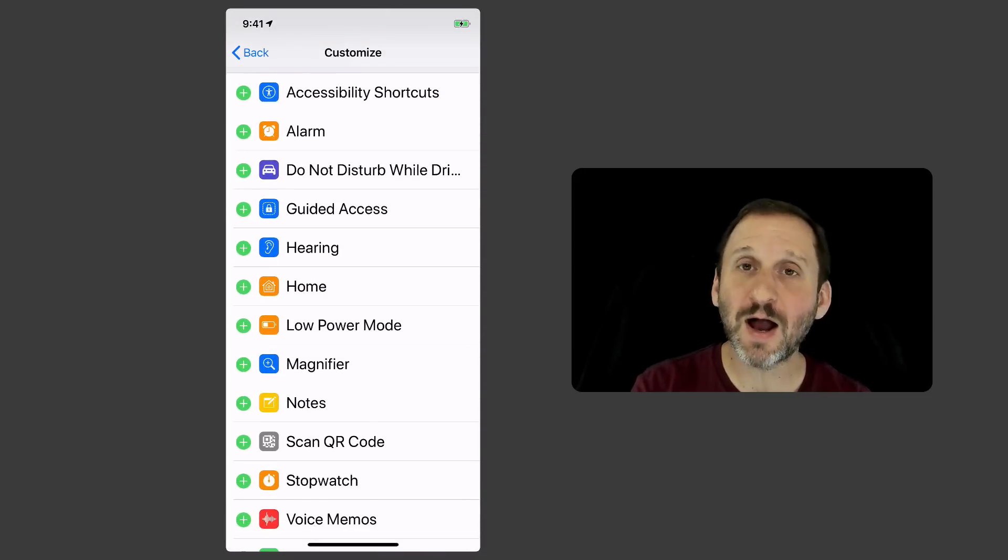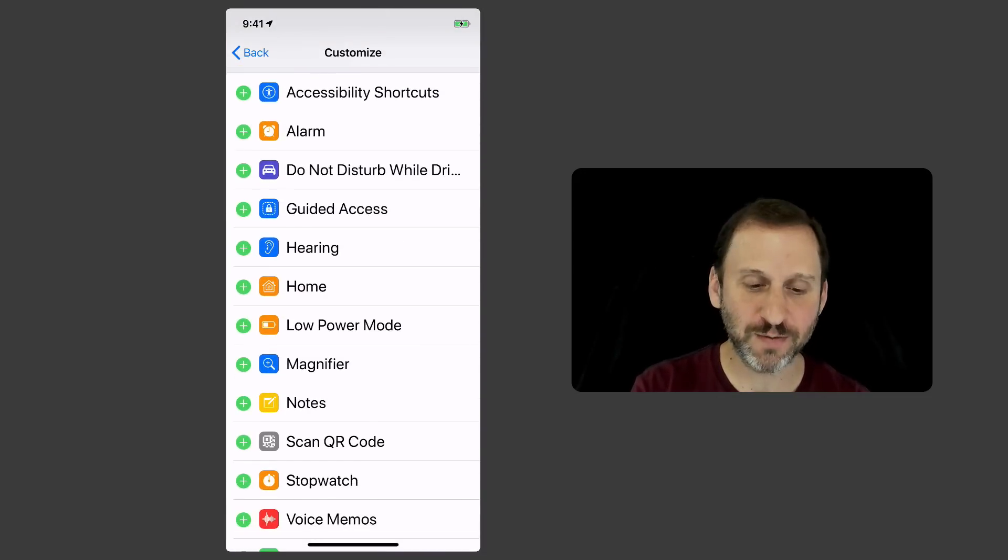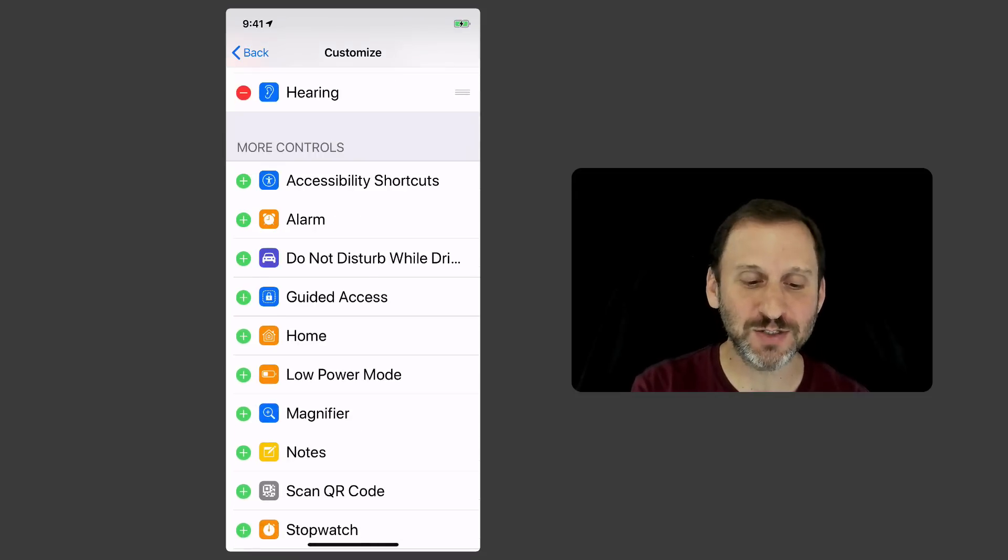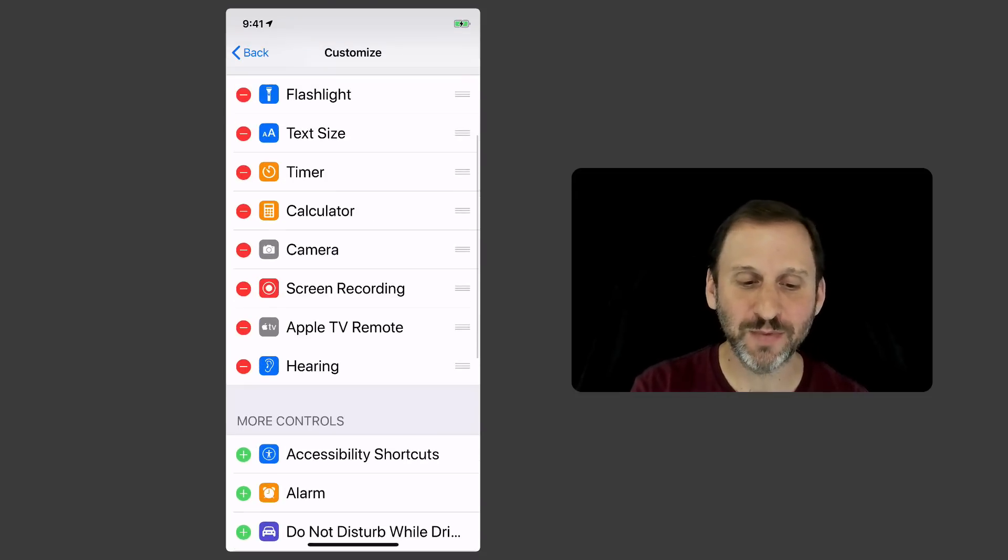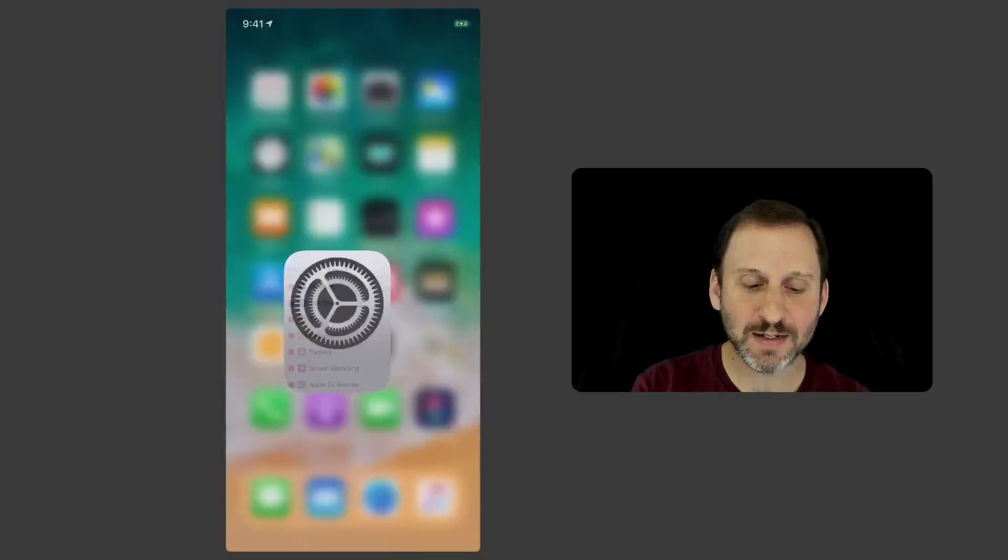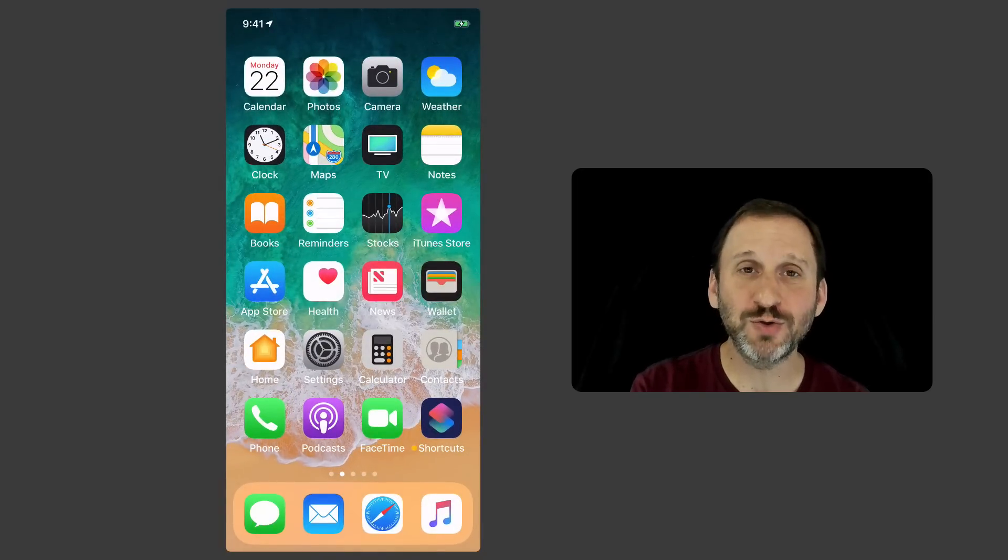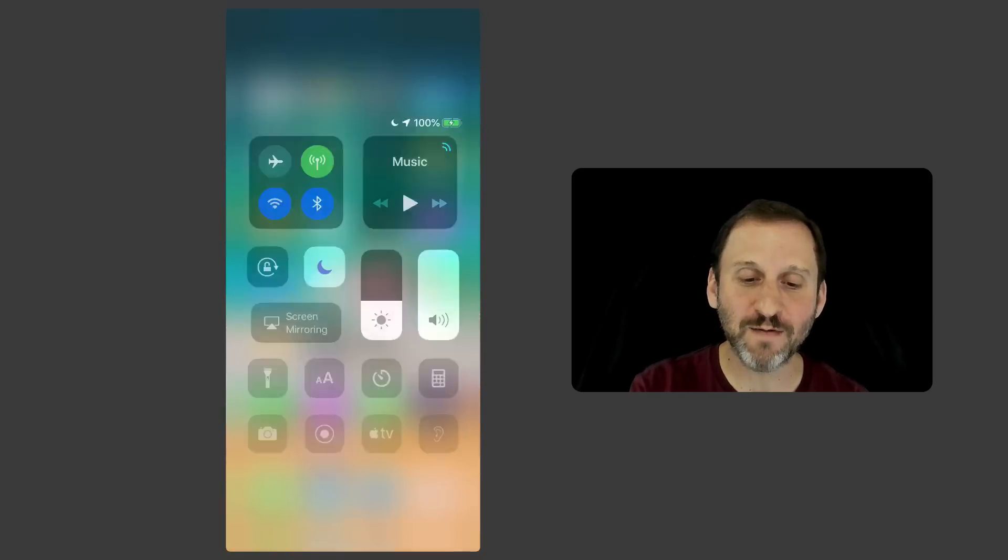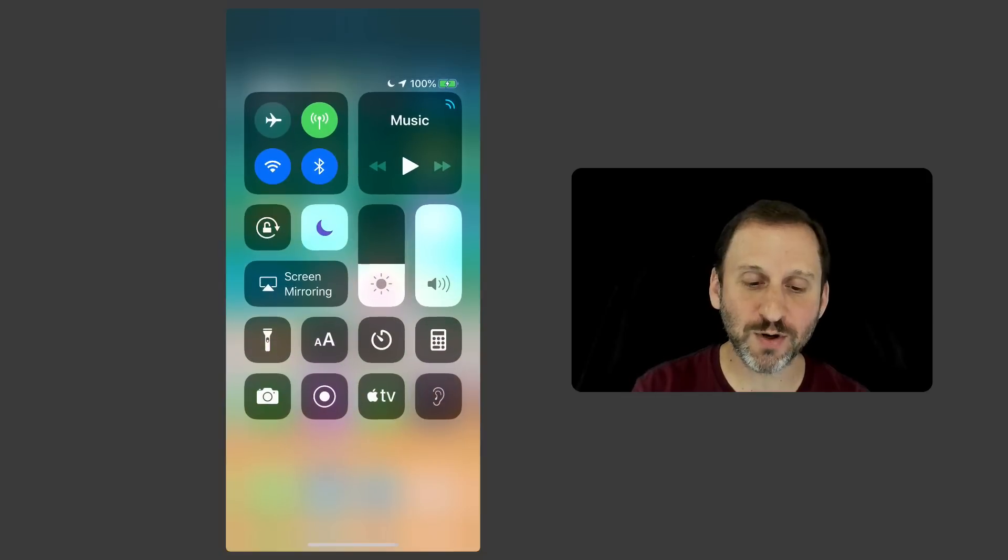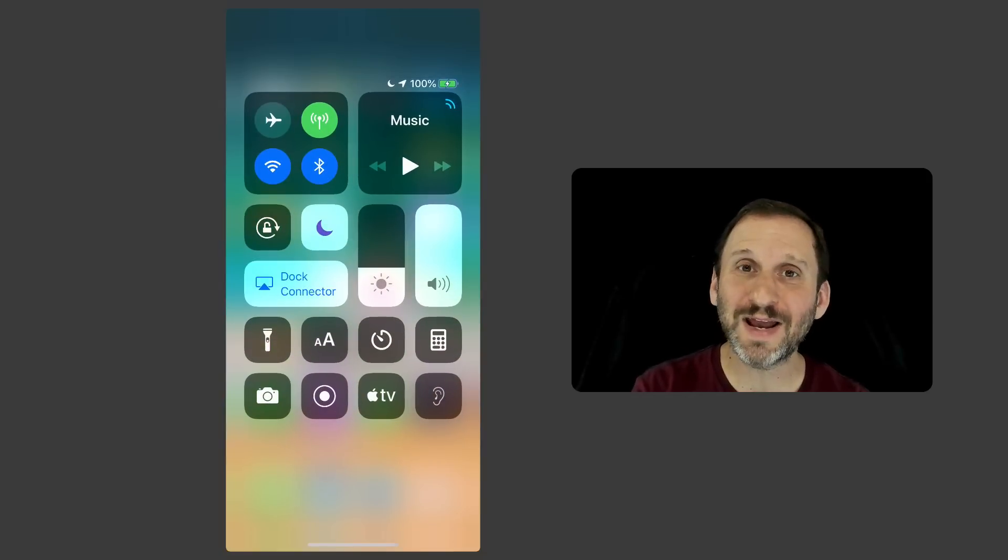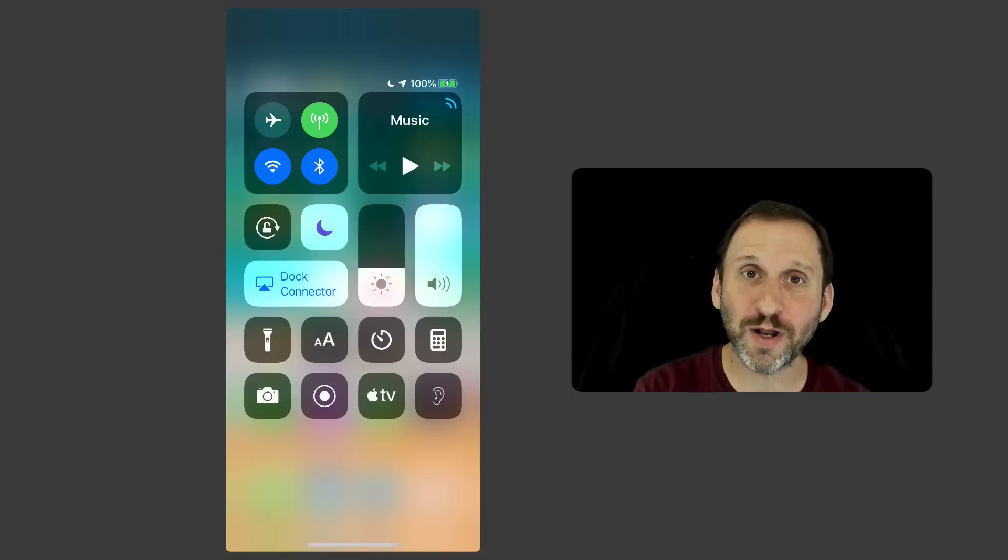Go into Control Center and you can Customize Controls. One of the items you can add to Control Center is Hearing. It's not even called Live Listen, it's called Hearing here. So you add that and now when I bring up Control Center on my iPhone X by dragging down from the upper right hand corner, I see that little ear icon there and I can turn it on.